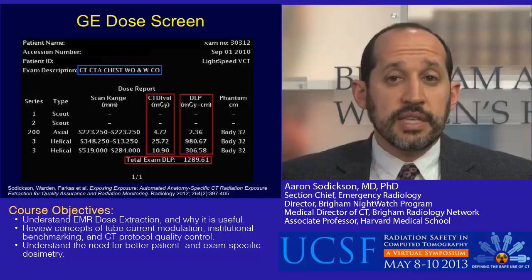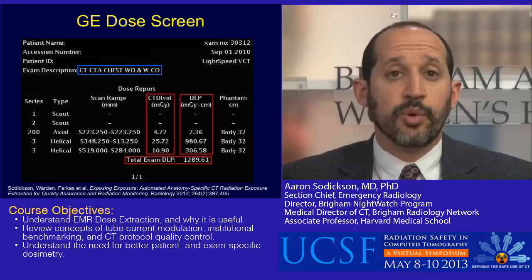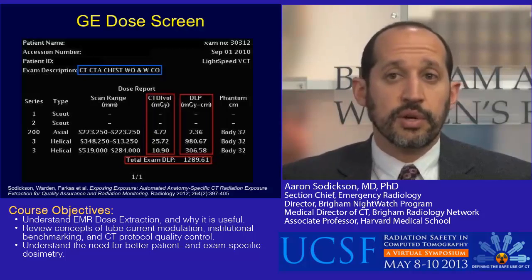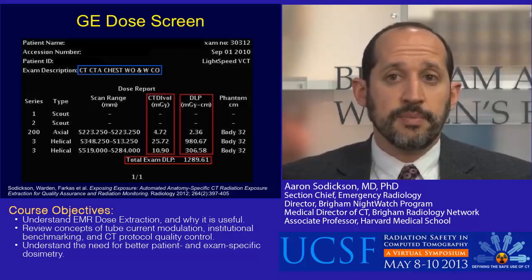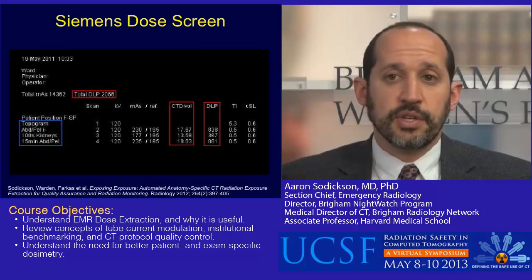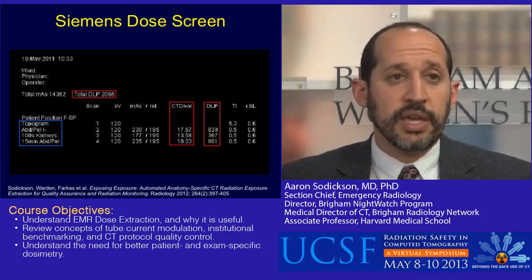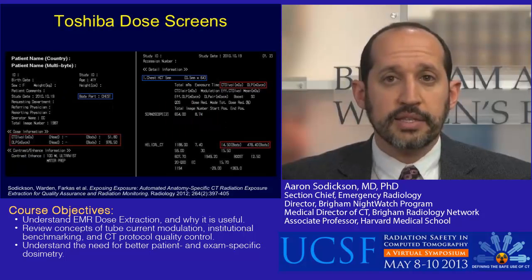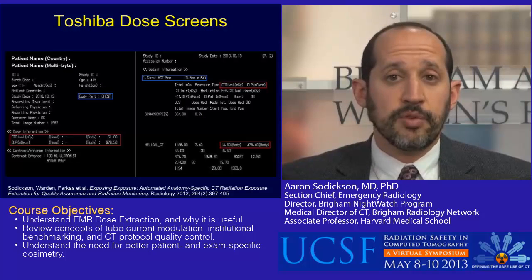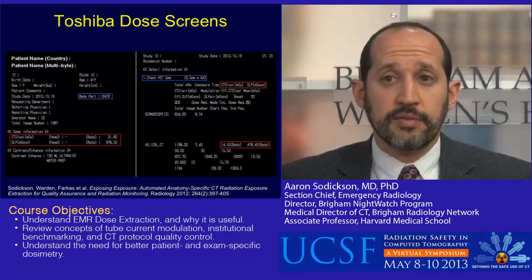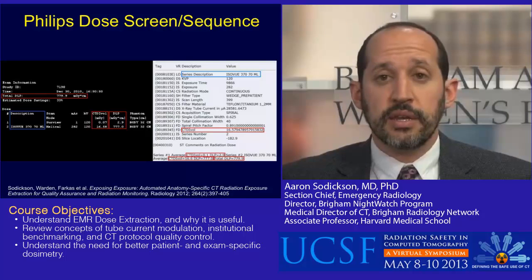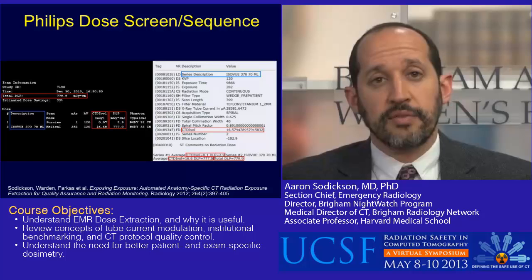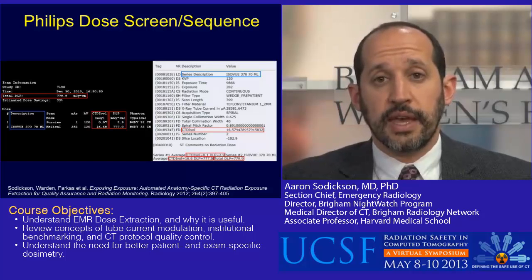All of the CT manufacturers produce dose screens where, for each portion of the scan, you can see a recorded CTDI vol and DLP. This is the GE version. Here's the Siemens version, with CTDI vol and DLP shown in the red boxes. This is the Toshiba version laid out differently, but all the information is there in red. And here's the Philips screen — again, CTDI vol and DLP for each portion of the scan.